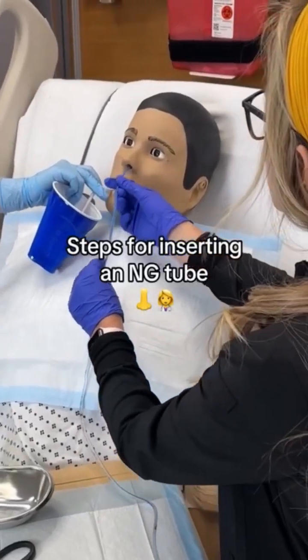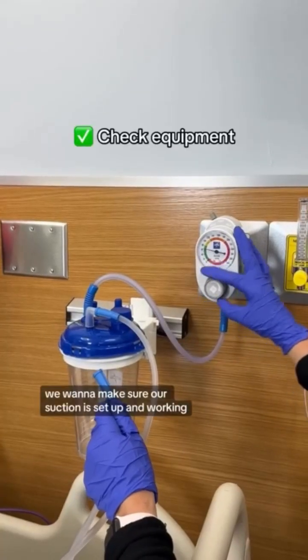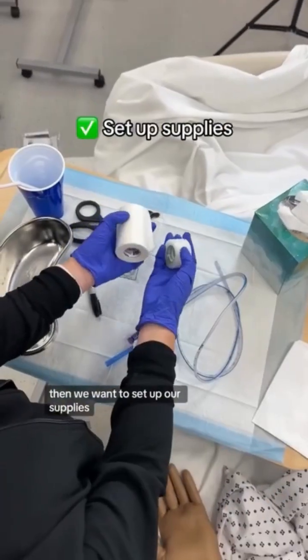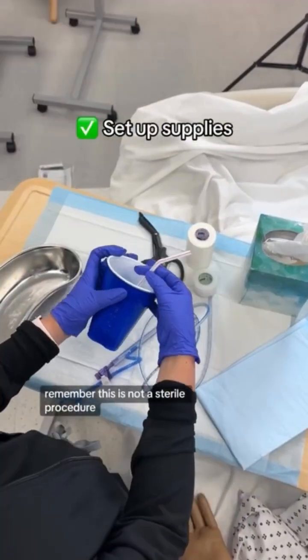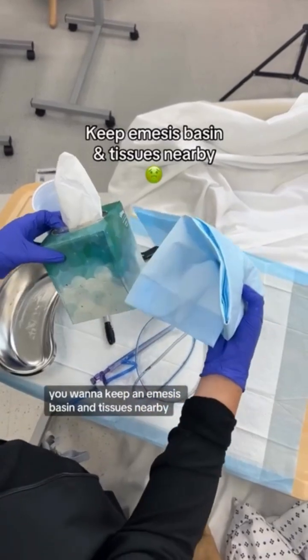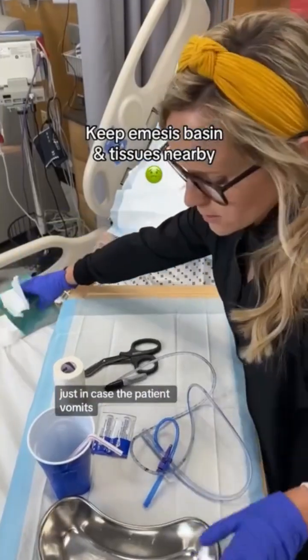Let's insert an NG tube. First we want to make sure our suction is set up and working. Then we want to set up our supplies. Remember, this is not a sterile procedure. You want to keep an emesis basin and tissues nearby just in case the patient vomits.